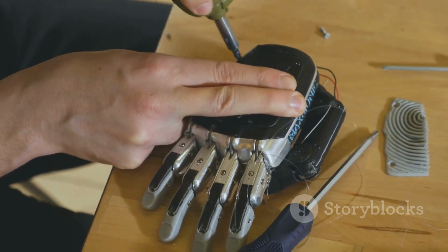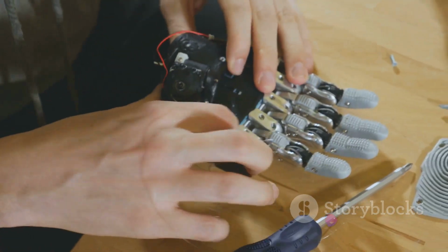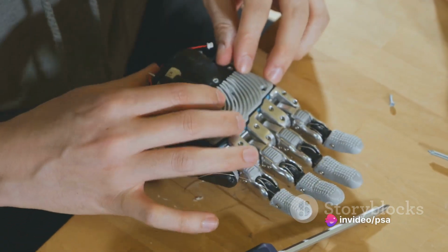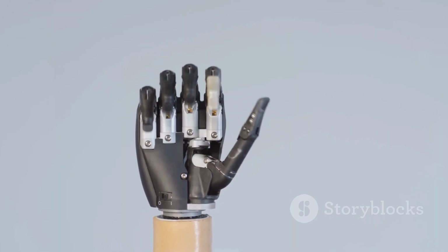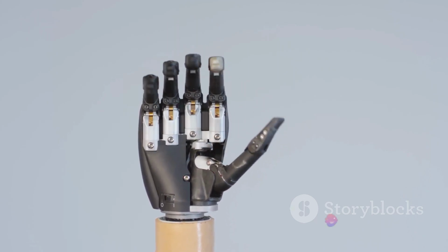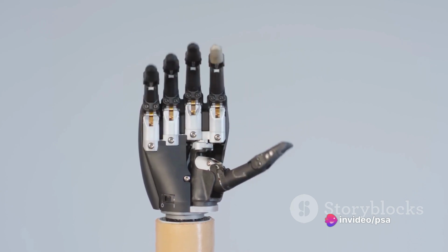In addition to energy efficiency, the researchers are also seeking to improve the device's adaptability. The current version is already impressively flexible, made from a thin, elastic material that can conform to irregular surfaces like a human finger. However, the goal is to further enhance this adaptability, allowing the electronic skin to seamlessly integrate with a wider range of prosthetic devices and body shapes.